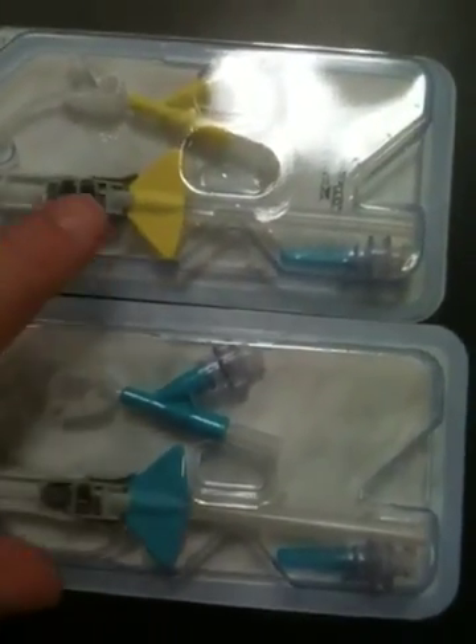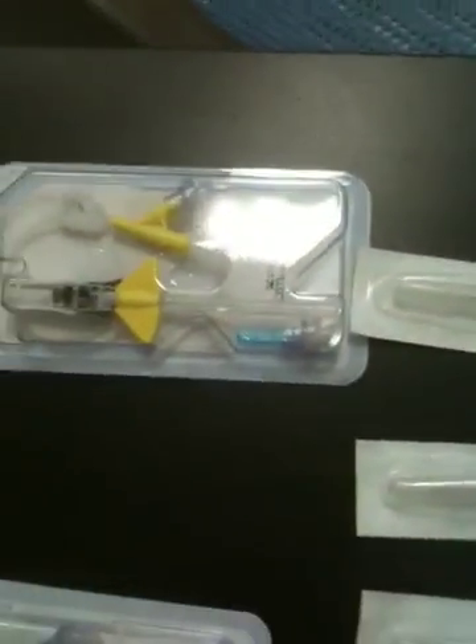It's the same thing with even different styles of needles. You can see this is a 22 and this is a 24. What you'll notice is the yellow in this style and a yellow in this style are both 24 gauge. A blue in this style and a blue in this style are both 22 gauge. A pink is going to be a 20 gauge. Green is going to be an 18 gauge. A gray is going to be a 16 gauge. And the bright orange is going to be a 14 gauge.